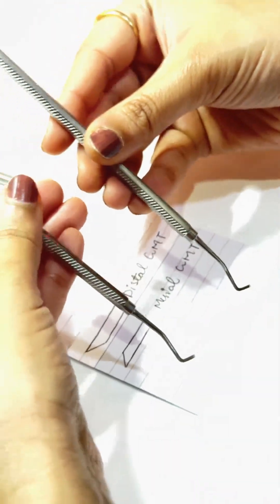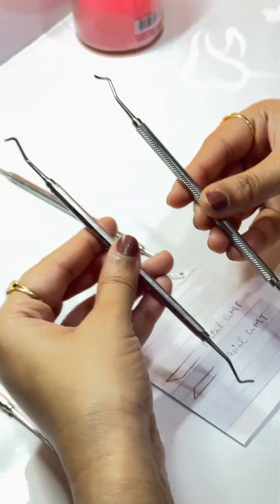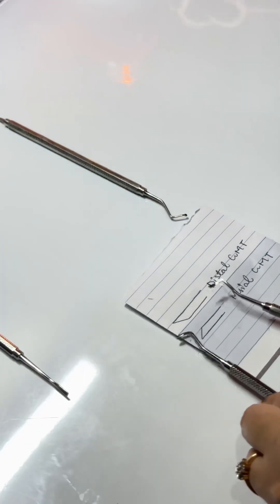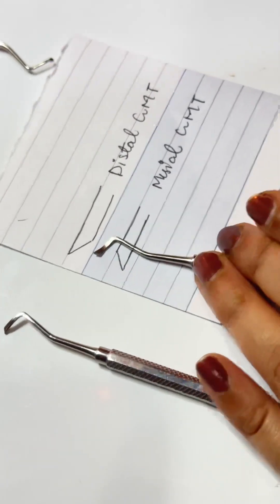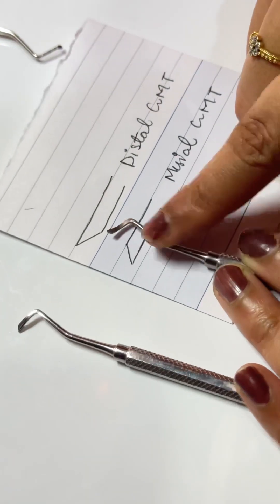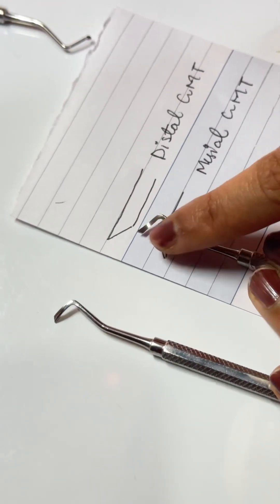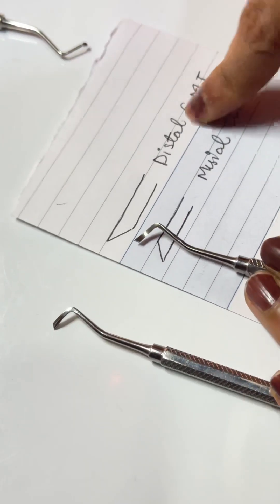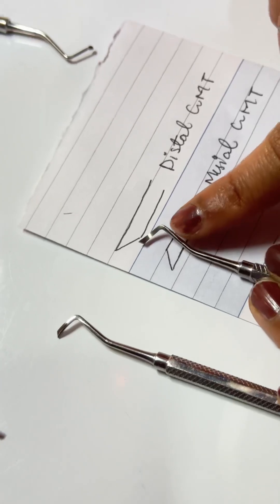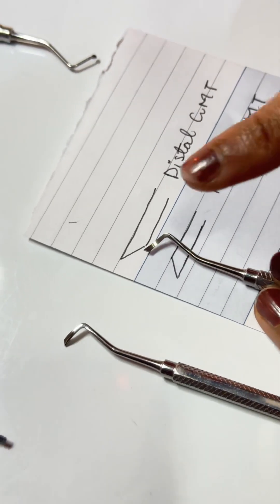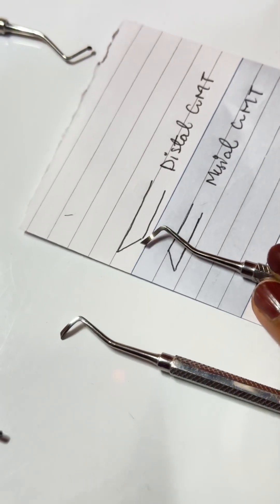Now let's find out which is mesial and which is distal. Focus here. See the cutting edge. Here it is pointing upwards. The cutting edge as I have drawn is pointing upwards, so this is mesial GMT.